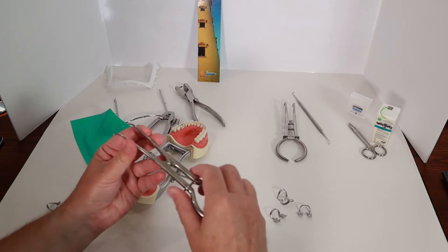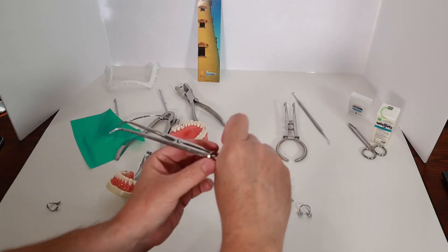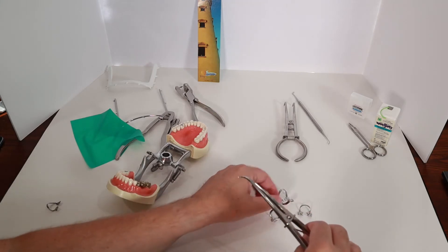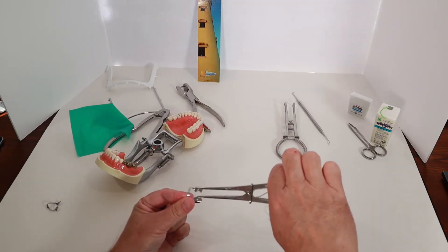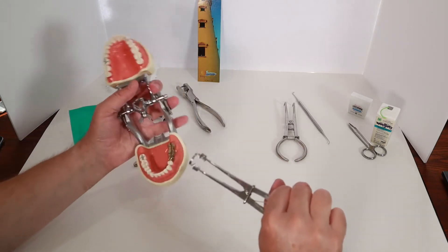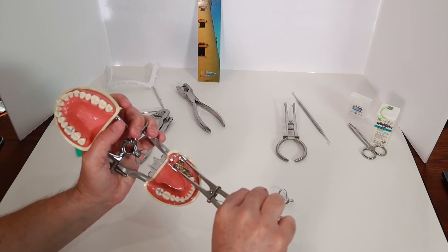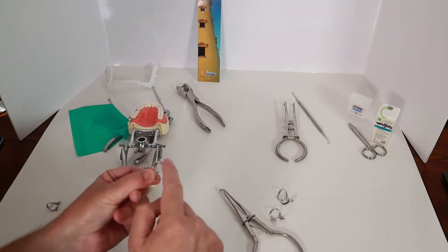Here's the tool that I use to place and remove the clips. The tips of the tool fit into the holes in the clip, then I spread the clip open and place it on the tooth. When I remove the tool, the clip stays in place. The clip fits around the tooth and squeezes it gently, which keeps the clip from coming off the tooth. The bow part of the clip helps keep the rubber dam away from the tooth.